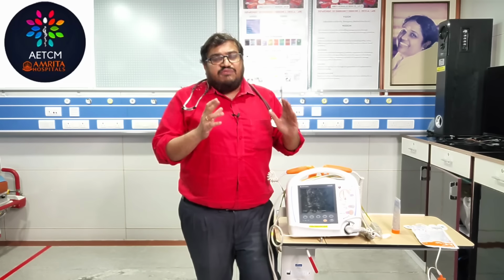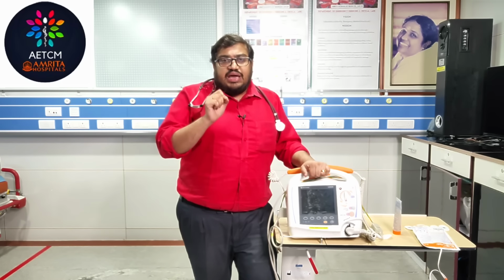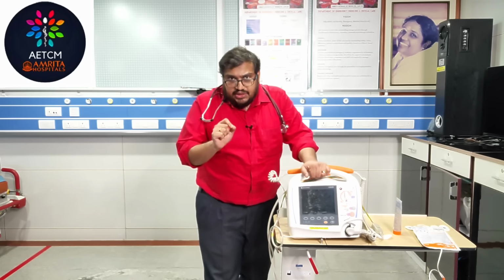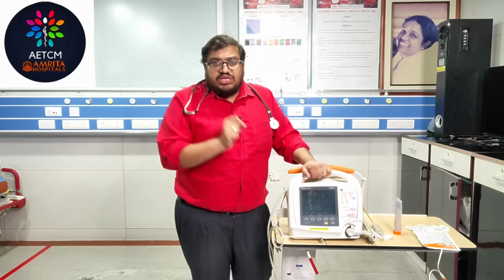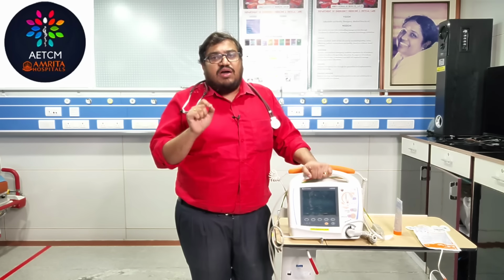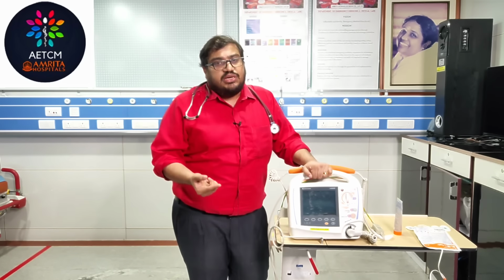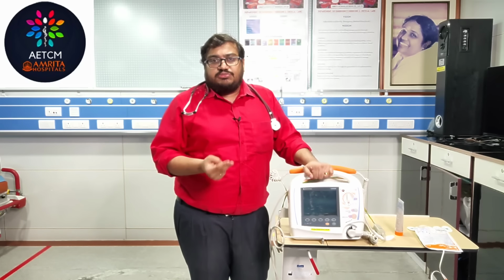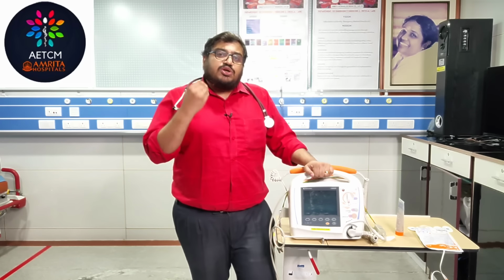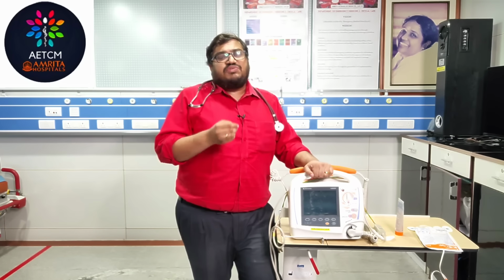Let's see what the key features of defibrillation are. In defibrillation, we use it only in a cardiac arrest where we find a shockable rhythm. Defibrillation means you are using your defibrillator in a case of cardiac arrest where you have a shockable rhythm. The next question: which are the shockable rhythms in a cardiac arrest? There are only two shockable rhythms in a cardiac arrest: pulseless ventricular tachycardia and ventricular fibrillation. These are the two rhythms where you have to deliver defibrillation in case of a cardiac arrest.